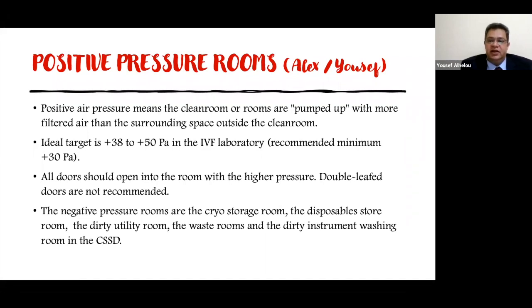So we need to keep those at negative pressure. And the cryo storage room should also be at negative pressure, in order to avoid nitrogen leaking outside the room if there is a leak inside.